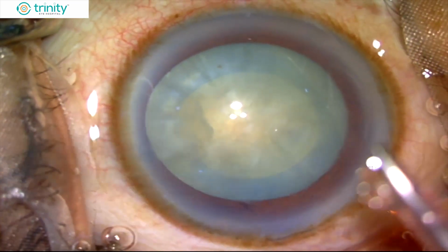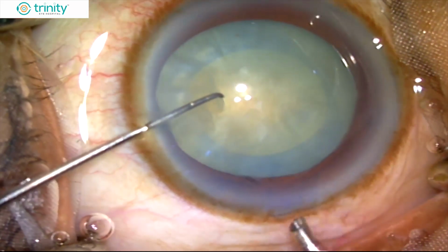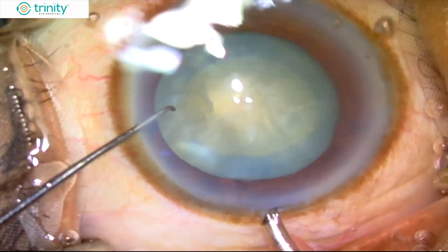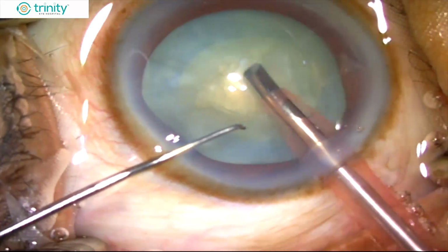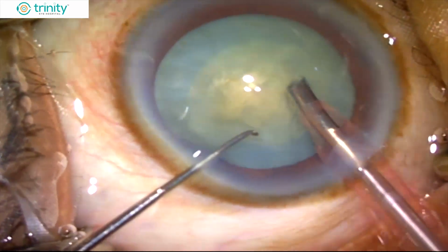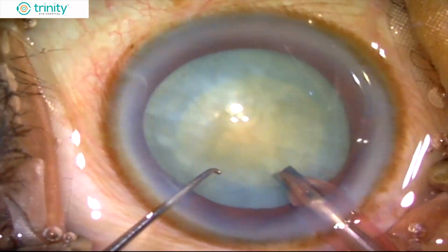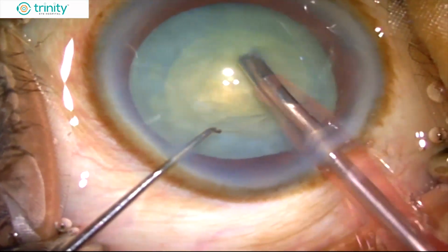Now I use a Centurion phaco machine. It's such a wonderful machine that especially in these kinds of complicated cases, the stability is so good that you can go to very low parameters and proceed with the phaco surgery with very minimal energy. I normally clear up the central area where there is a loose cortex, so that the energy can be reduced during the trenching.